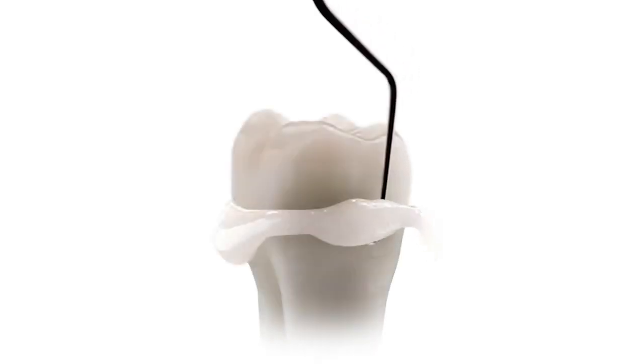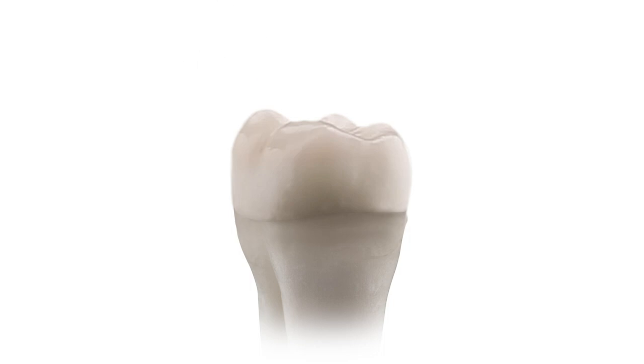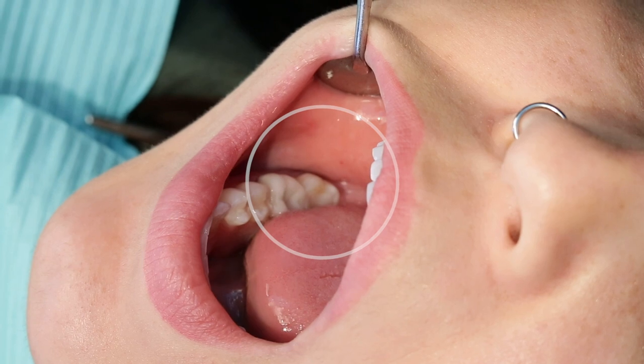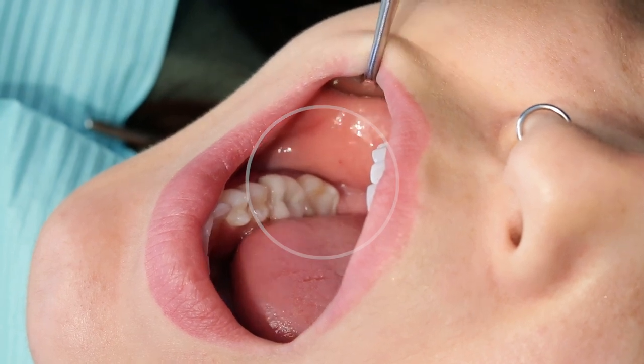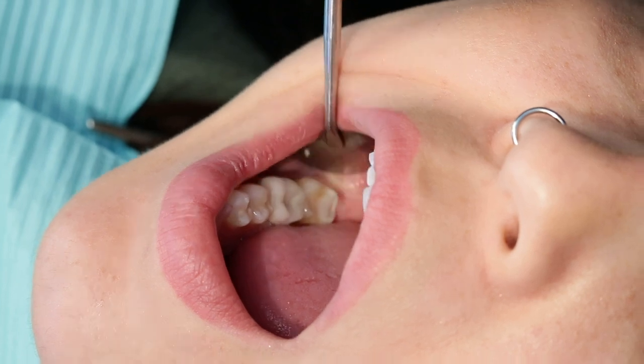Let's review it in use during a single unit crown procedure. Matching the right cement to the selected restoration substrate is key to clinical success. This single unit crown procedure on tooth number 31 has been previously endodontically treated. Because of the posterior location, a high strength zirconia material is selected.